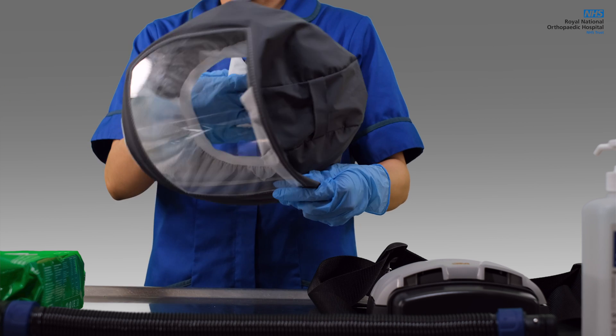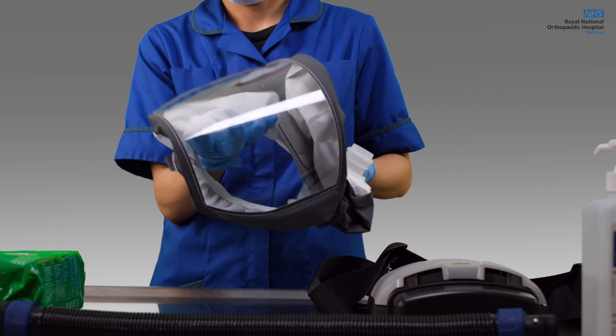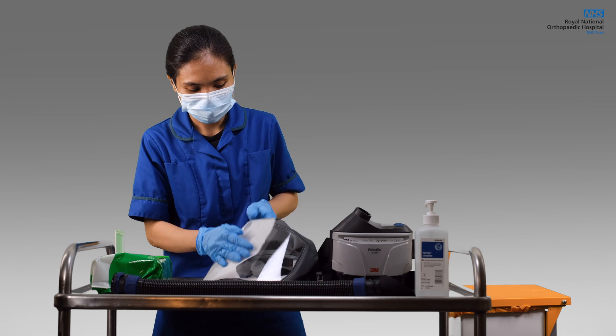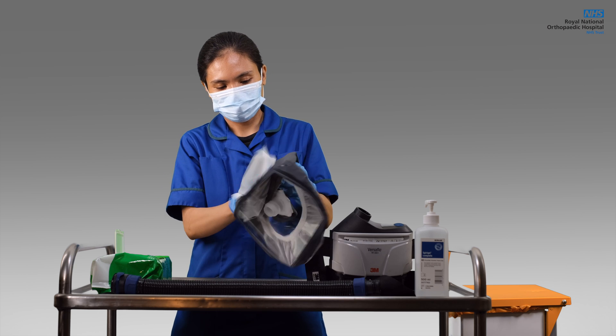Always use one fresher wipe for the inner portion of the hood. Make sure not to use the same wipe for the other parts of the unit to avoid contamination. Lastly, clean the outer part of the hood, making sure all creases are covered. Then gently put it aside to dry, ready for next use.